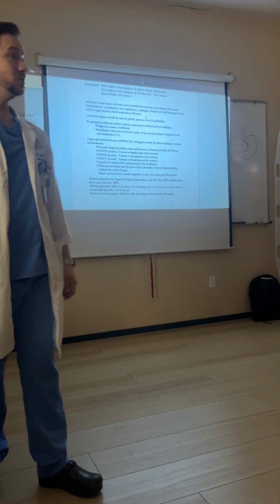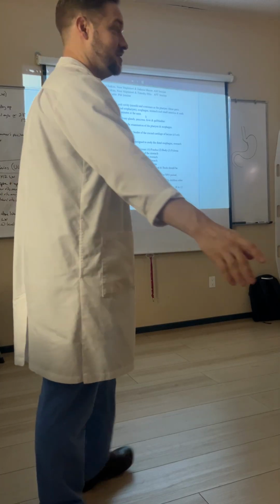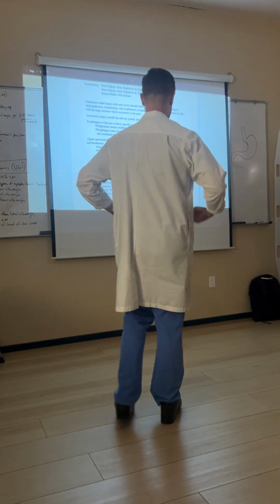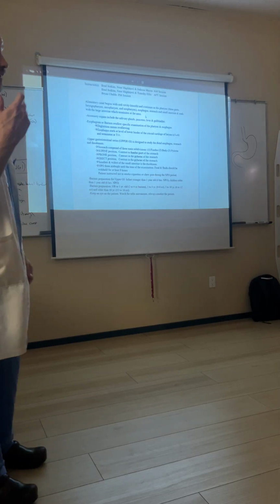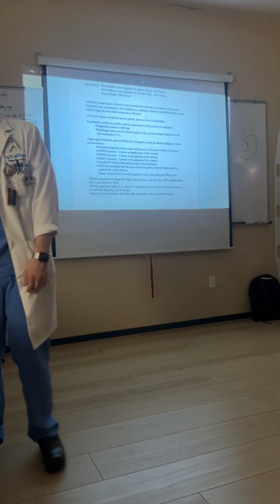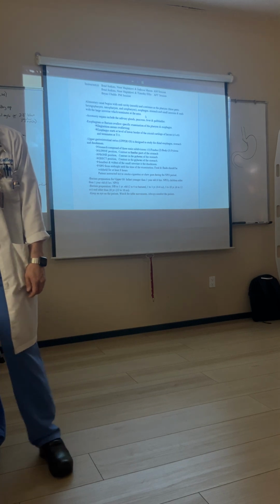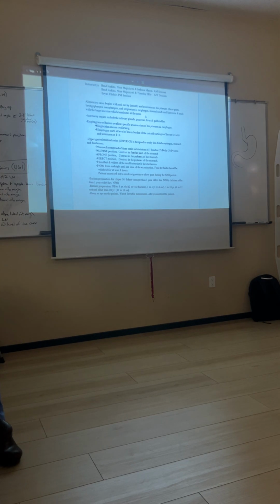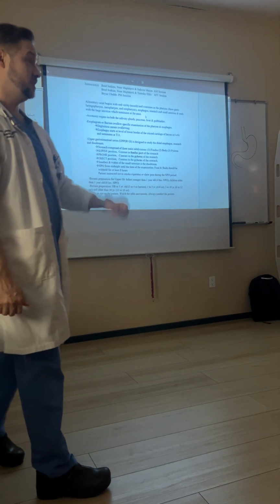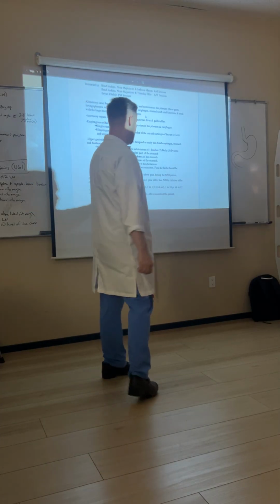So whose job is it to look at the patient? Yes, all of you. So keep an eye on the patient. Watch the table movements. I've said this before too. Again, the radiologist is going to be moving the patient either with buttons here, or he's got a little switch or joystick, whatever. He's not going to be looking at the patient. If the patient for some reason decides to put their hand here and the radiologist moves the table that way, what's going to happen to their fingers? Ouch. Okay? So watch table movements.